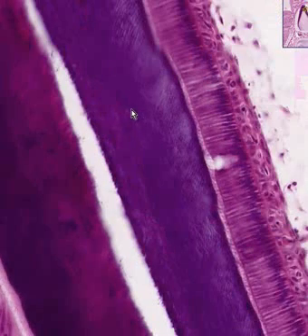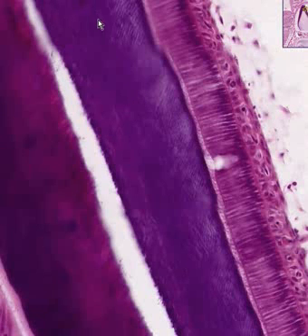Right next to the enamel line, which is made by the ameloblasts on the outside, and these little lines here are called Tomes, T-O-M-E-S processes. So that's the part that we did not see in the previous one on tooth development.